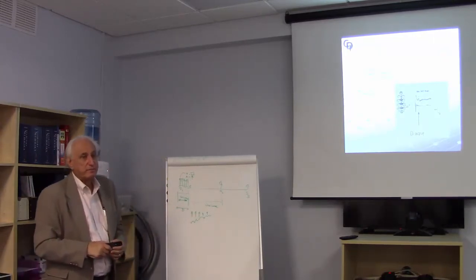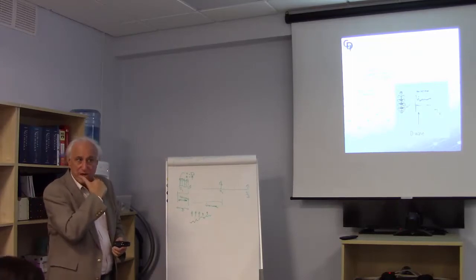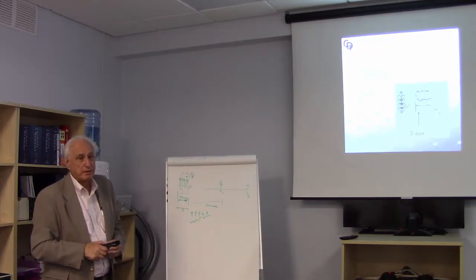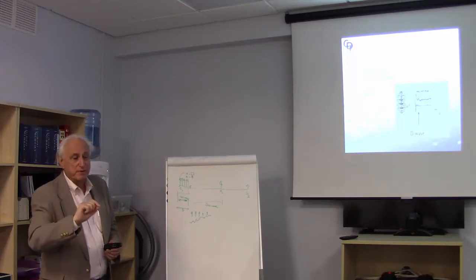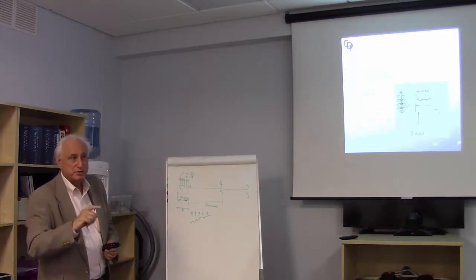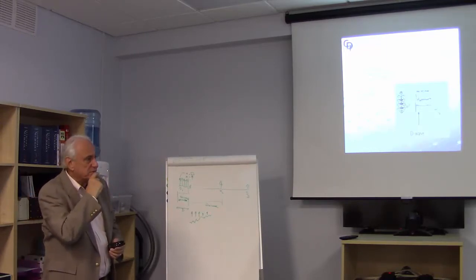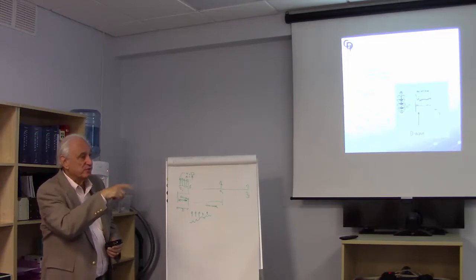In the United States, we do a lot of spinal cord stimulators. Are you familiar with those for chronic pain? Those are all epidural paddles, and I've never seen epidural bleeding sliding those in. But it's very thin, and this grid is like a plate. Well, no, they're really thin also. Actually, there's some downstairs. Maybe that bag I gave you, there's some. Maybe later we can get some of those and I can show you.